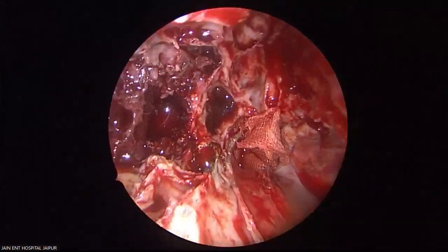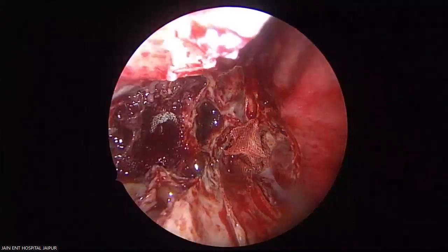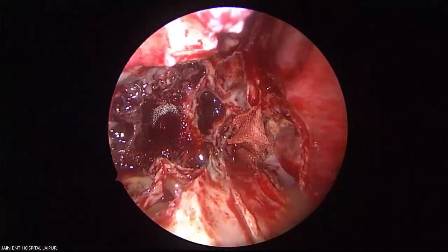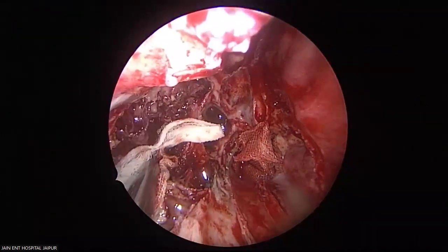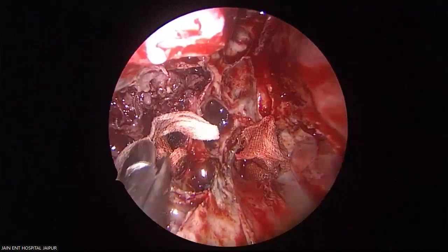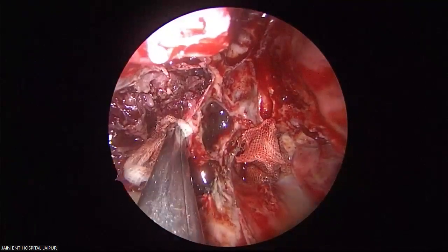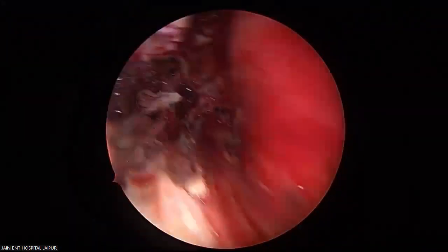So you can see this panoramic view, a full panoramic view to see all the area. That's the beauty of endoscopy, not only intraoperatively, but postoperatively as well. You don't need to go for radiology unnecessarily.